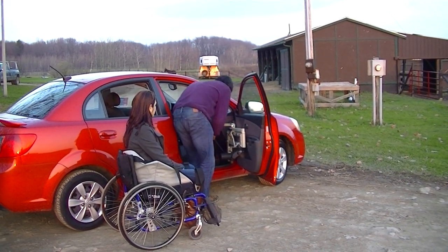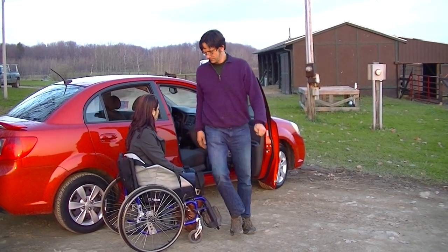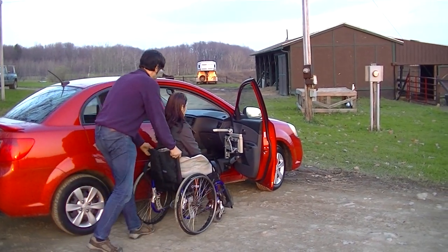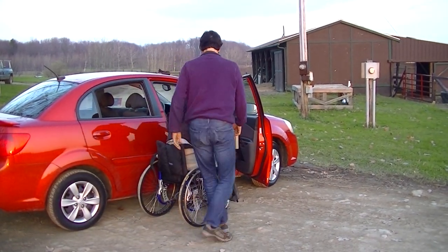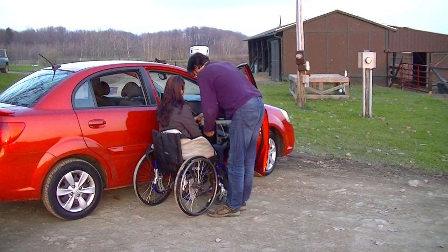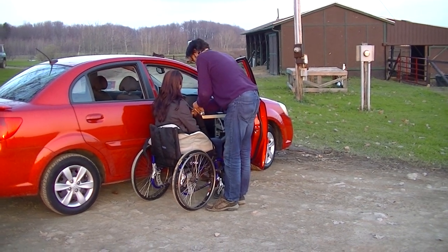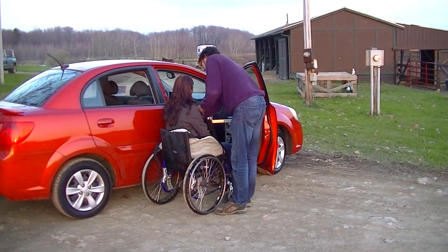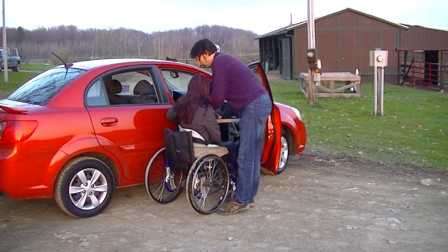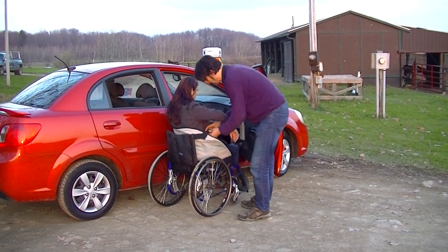We're going to connect the battery up here. Now we've got power. Move over to be closer to the vehicle. First, we're going to attach the leg tabs. Secondly, we'll attach the arm tabs, starting with the farthest away, going to the closest.